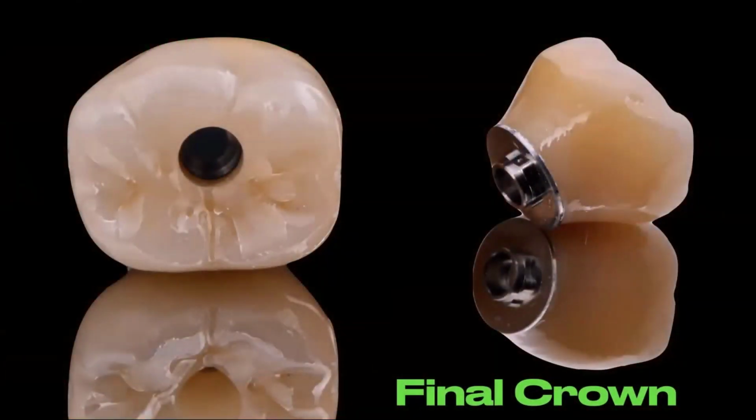And then we look at the final crown. And if you look at the contours of this final crown, we always show these photos and they look like, wow, what great photography. This looks so cool, looks so nice. We take a photo on a mirror and it looks so cool. But in general, it's not the wowness of the photo that matters. It's the contours of the restoration that matters.